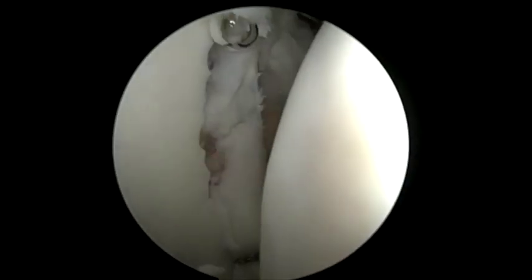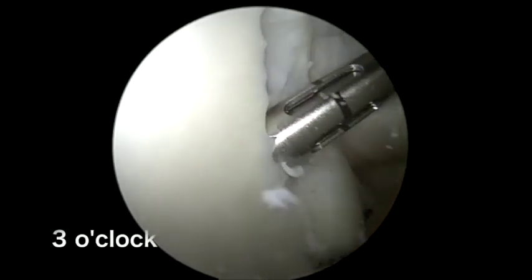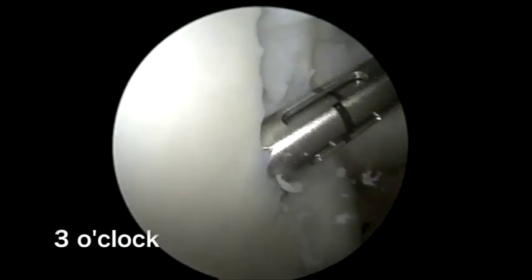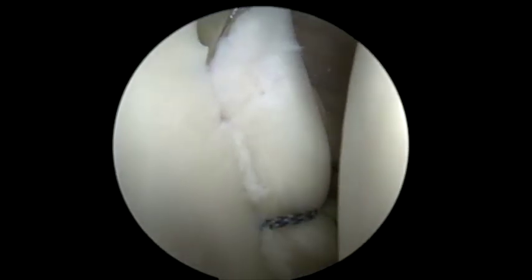Moving on, we highlight the following steps. After anchor insertion at the 3 o'clock position, the capsulolabral complex is grasped using a grasper and provisionally reduced to the anchor insertion site.